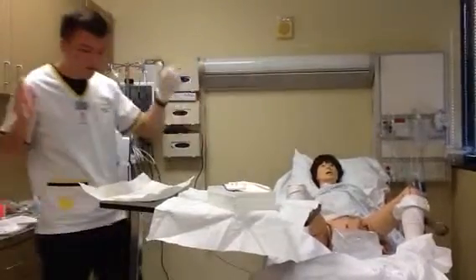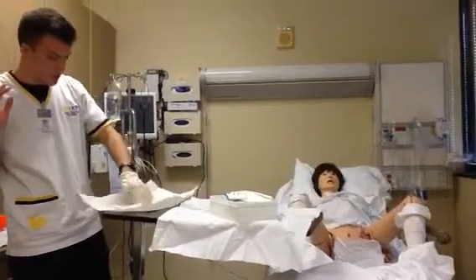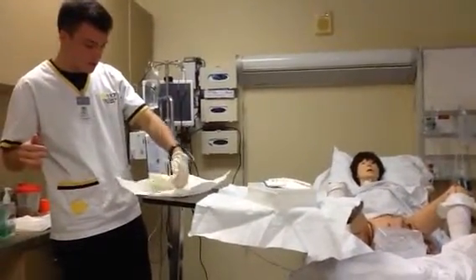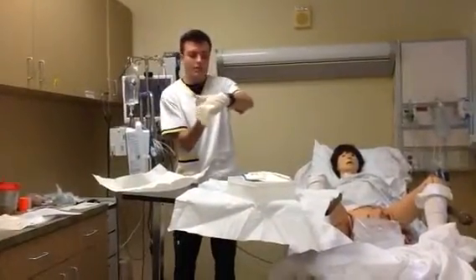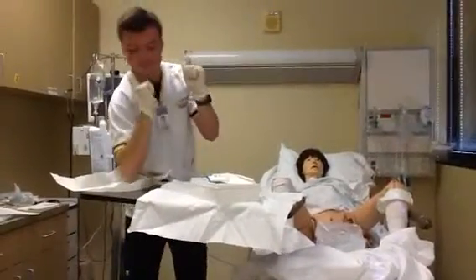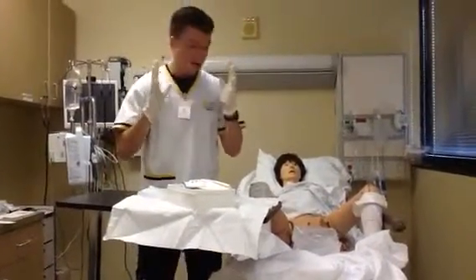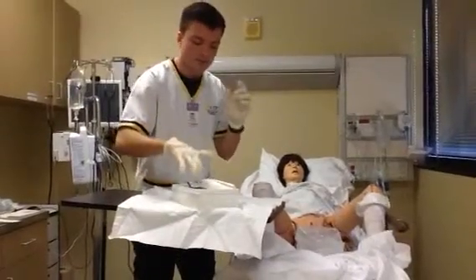Alright, and it is ready to go. Thumb out. It will scoop up underneath. Take a step back, my hand supinated. I will don my sterile gloves. So I am now sterile, making sure to keep my hands above my waist and below my head. And I am ready to perform the sterile procedure.